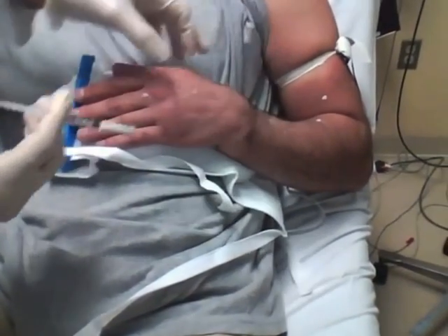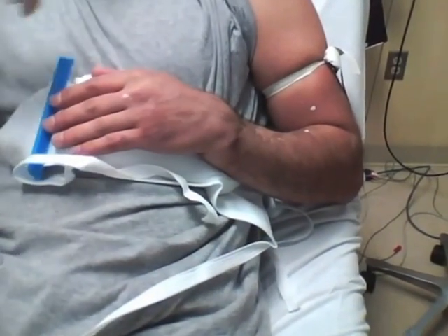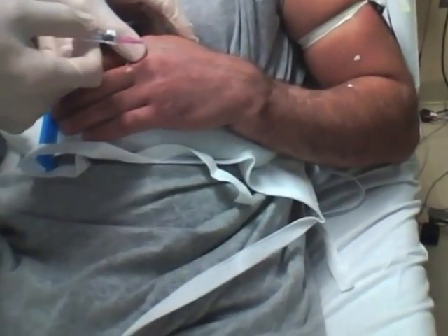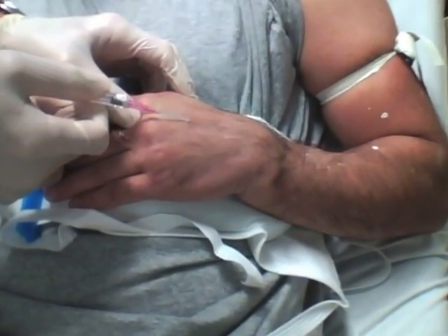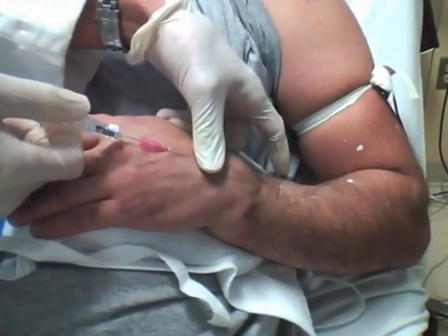Once the solution is prepared, an intravenous catheter is placed in the affected arm. It can be placed above or below the injury — it really doesn't matter. It's generally a good idea to raise a little wheal of lidocaine prior to placement of the intravenous catheter. The catheter is inserted like any other intravenous catheter and converted to a saline lock with an access port, then taped into place until you're ready to inject the lidocaine solution.